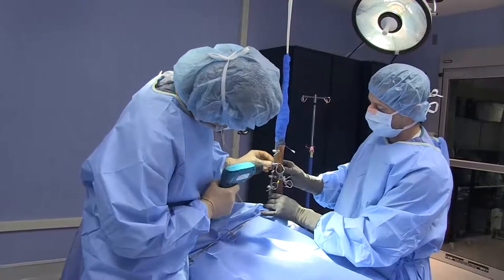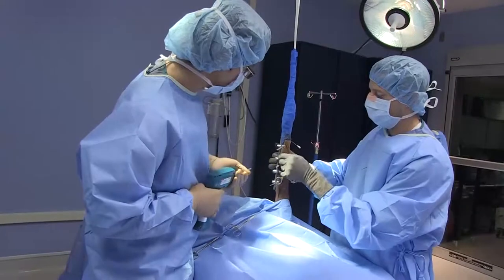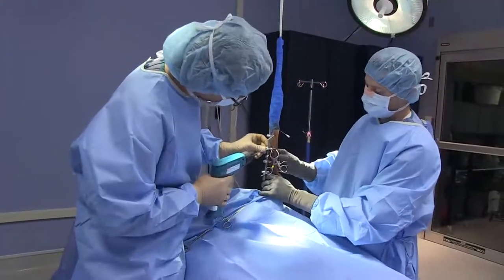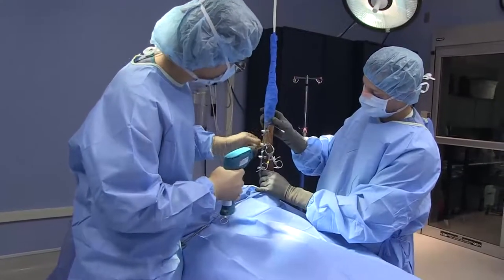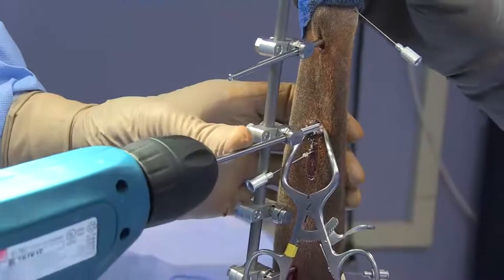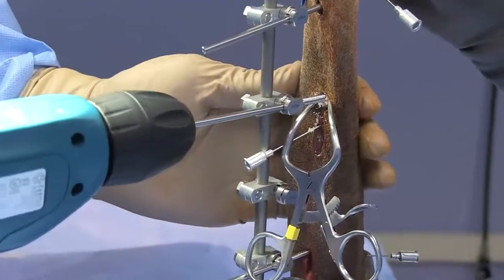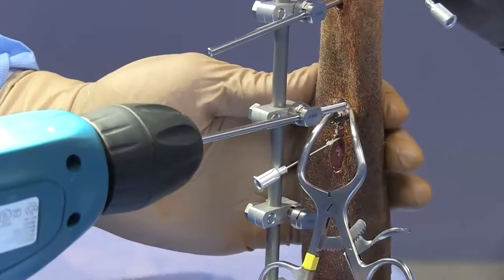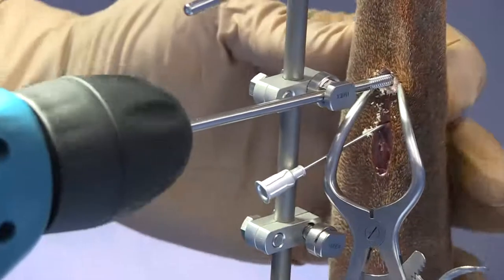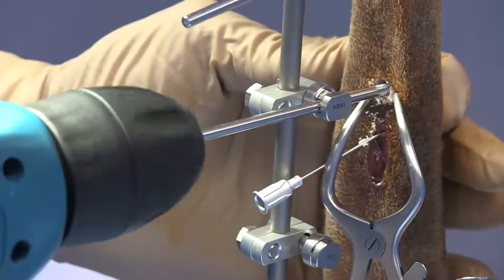This pin insertion can be done through the clamp. If you didn't pre-place the clamps, that's all right — the nice aspect of this system is you can disassemble those clamps and put them on later if you need to. We'll get our pin into that clamp — we want it pretty loose so it doesn't get bound up in there. We'll go ahead at a low velocity and get that fixation pin engaged.